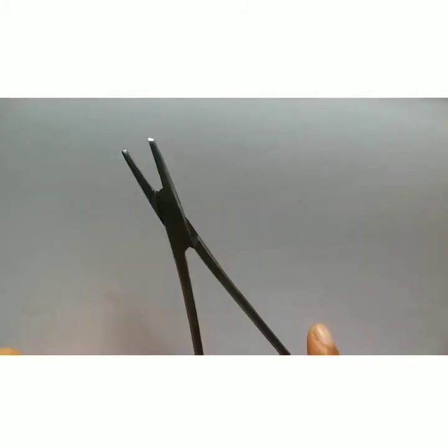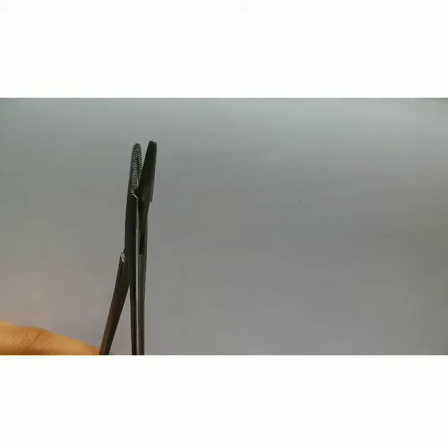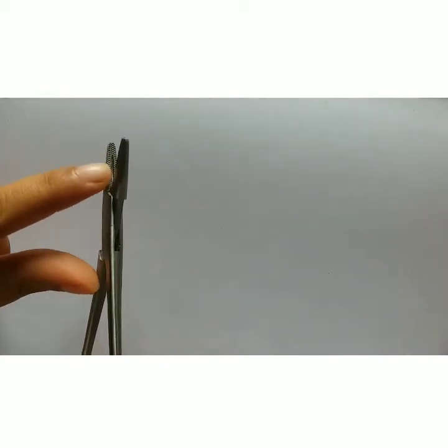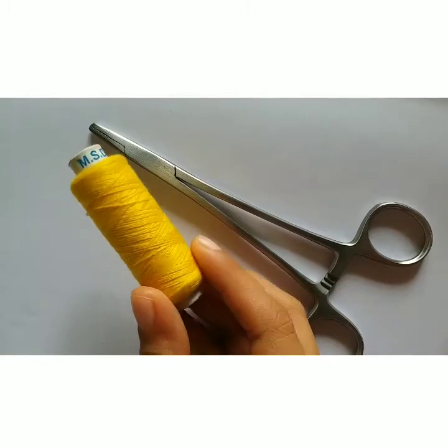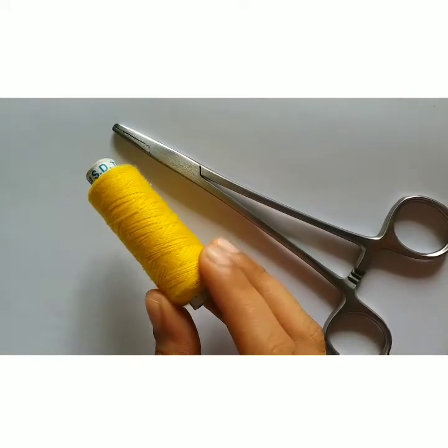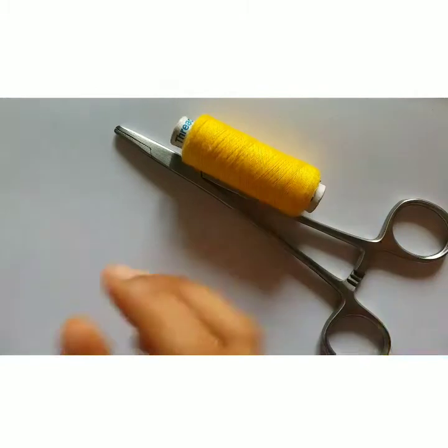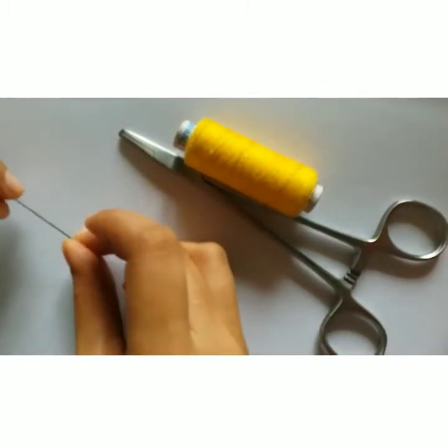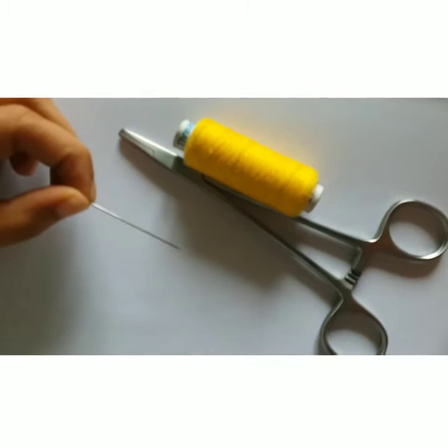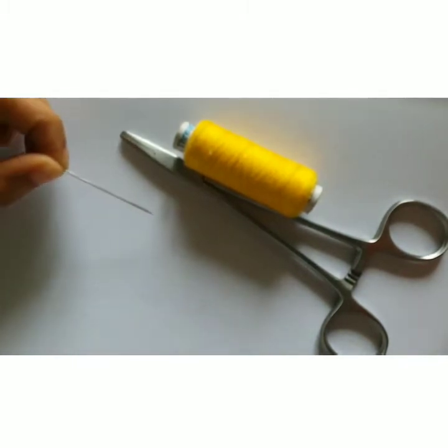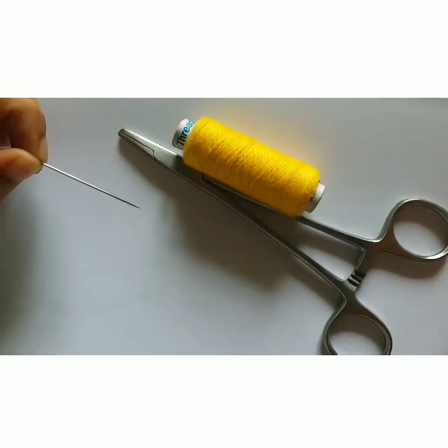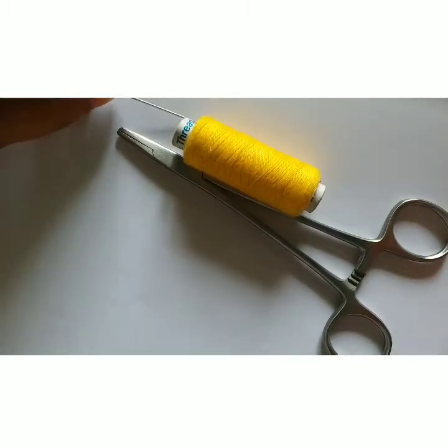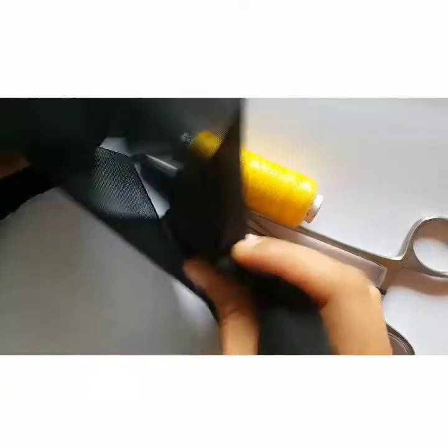We need to practice with needle holder forceps, which has a groove for better grasp over the needle. Then we need a thread. We use this thread in the material place. Next, we need a needle. Mostly, this needle and thread is available in every house, so we don't need to practice with actual suture material or suturing needle. Then we need a ribbon.